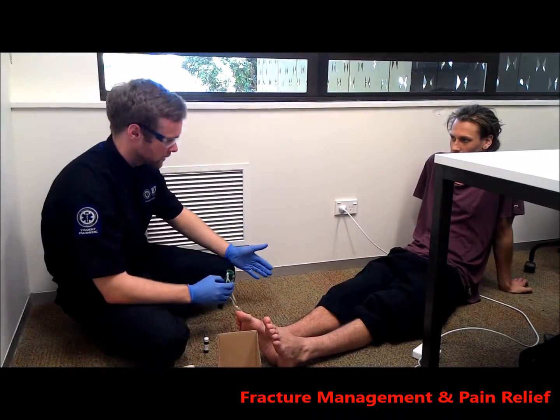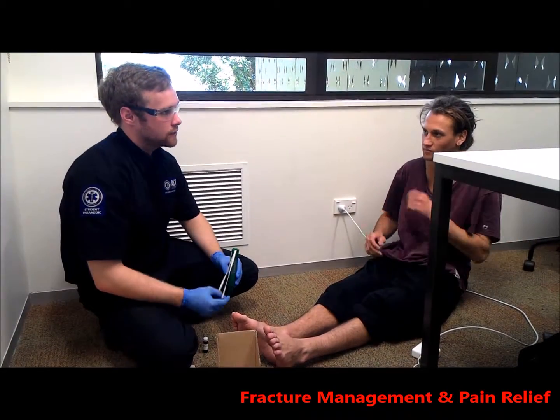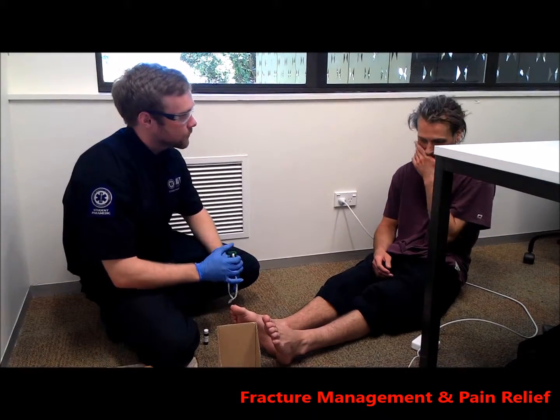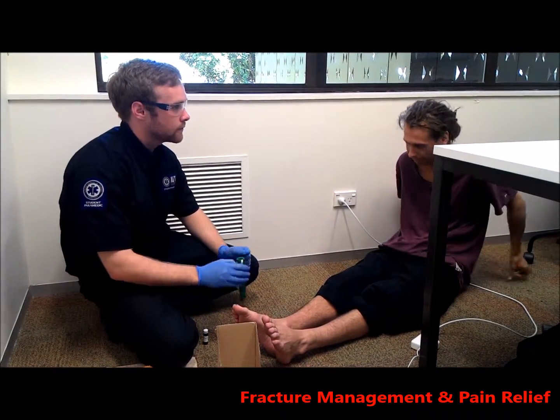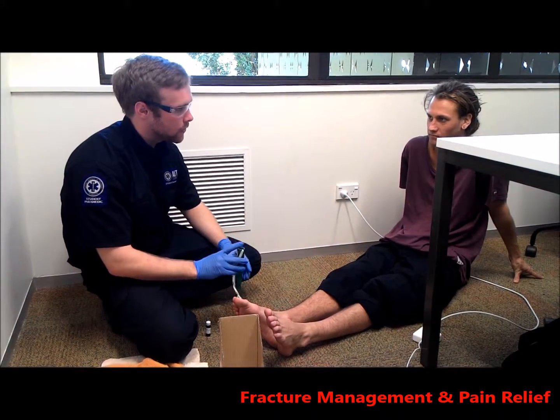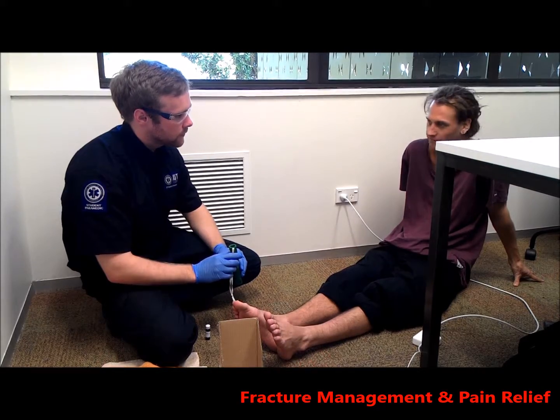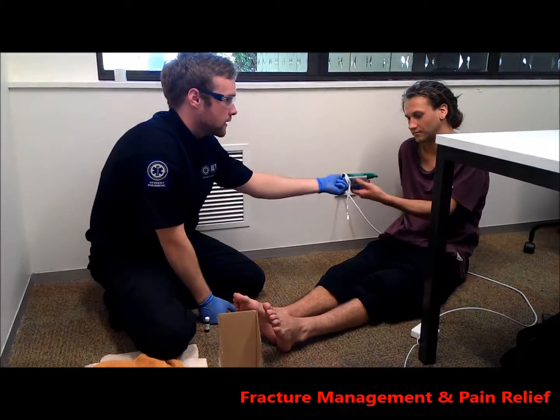So Sam, could I just get you to sit forward, please? Do you have any known renal impairment? No. No renal impairment. Have you had any methoxy in the past week? Nope. And so you can also follow commands. And do you have any known history of malignant hyperthermia? No. Nope. So I'm going to get you to just suck on this. Take a few deep breaths.